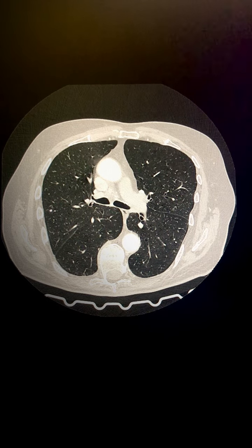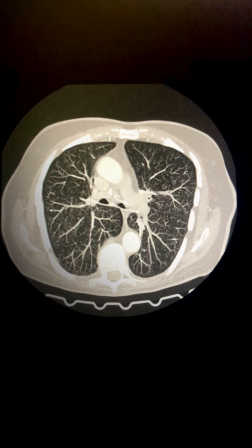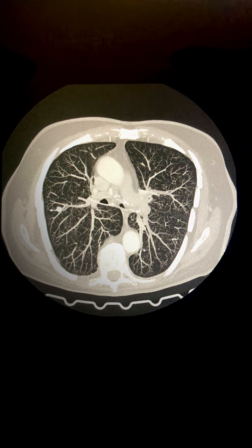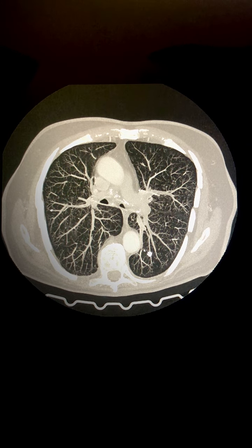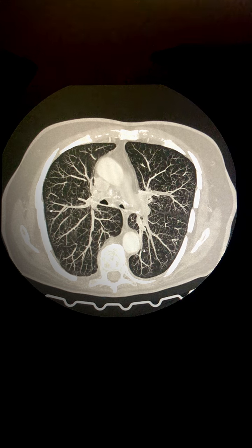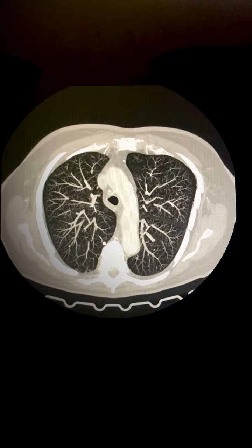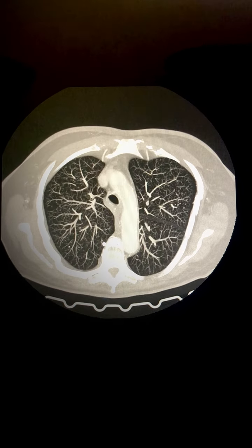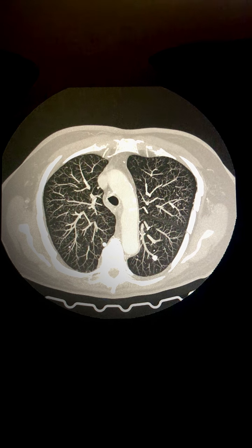We are just going to MIP it so you can see it better, and here you can see the calcific intrapulmonary nodules which have occurred as part of occupational lung disease, and in this case most likely silicosis.